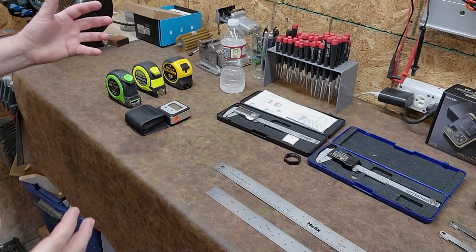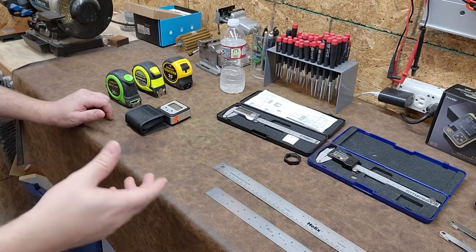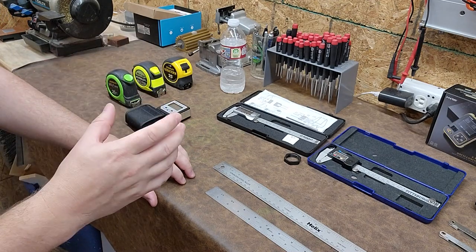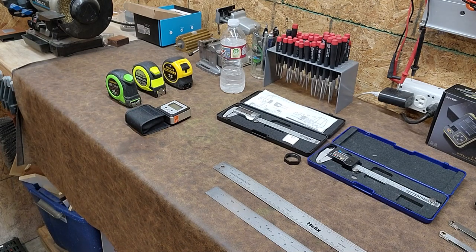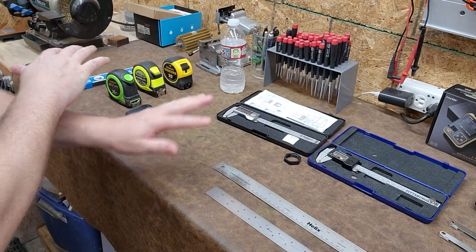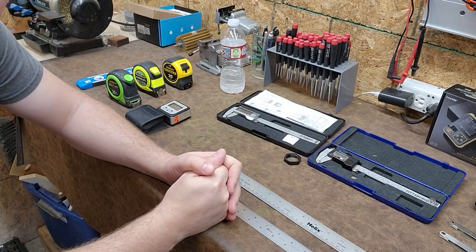Hey guys, welcome back to Better Biomed. Today, by request, I'm going to do a video about the various different types of measurement tools that we use in our career field. Some people just don't believe that these tools are something we should have, and furthermore a lot of people just don't know how to use them correctly. So let's go ahead and take a look at some of the stuff we use and why you might want one in your toolkit.